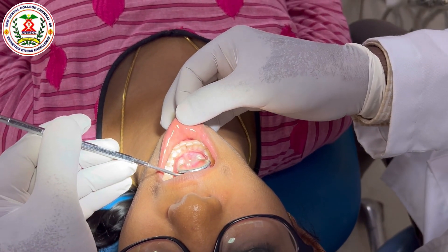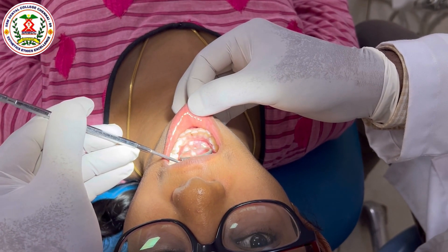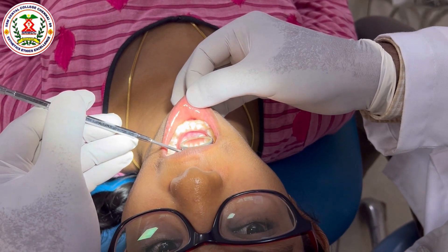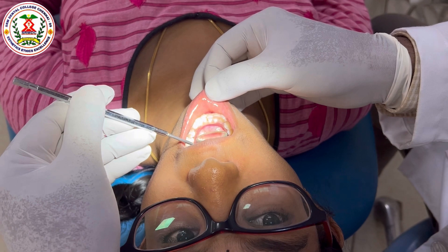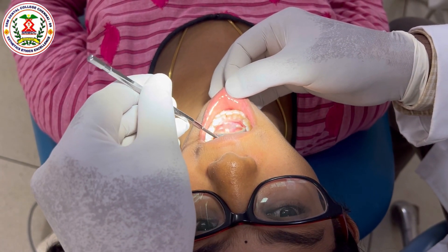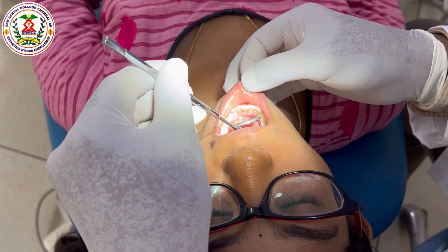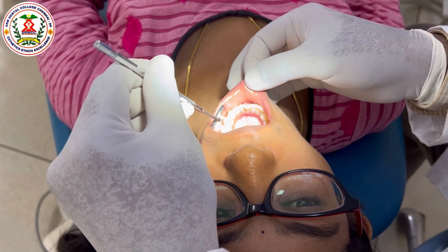I will also talk about indirect illumination. Once the light is at 90 degrees to the mandible, if you put your mouth mirror inside, you can reflect it for extra illumination on the lingual side of the maxilla and the mandible. Both the mouth mirror and the light help to give you extra illumination, which can improve your visual acuity.